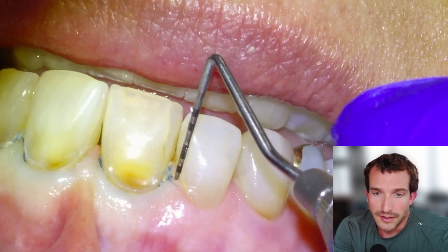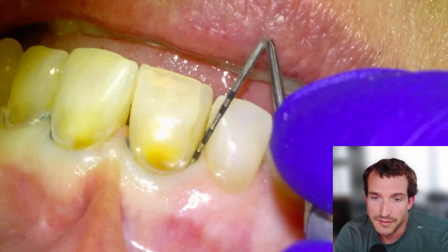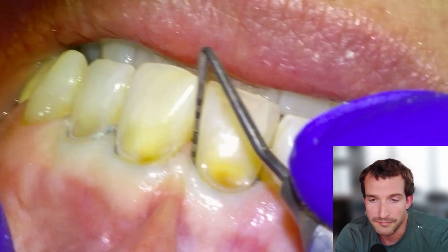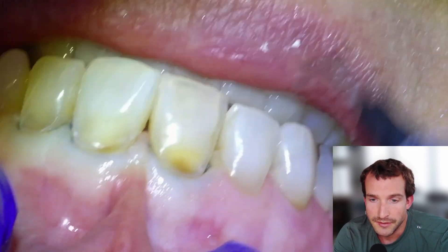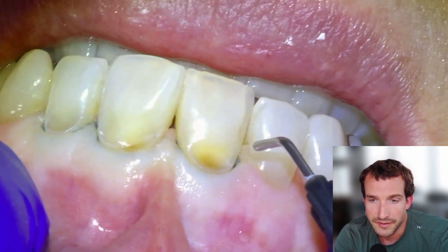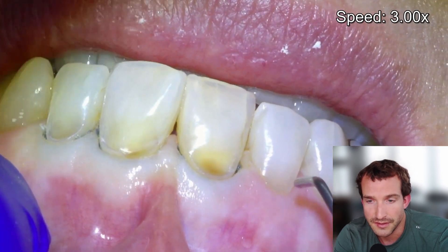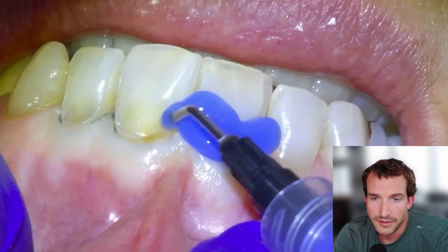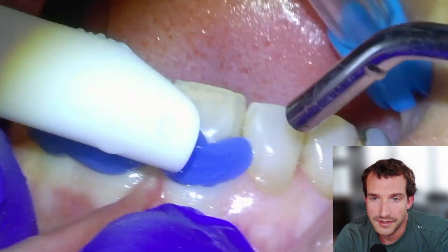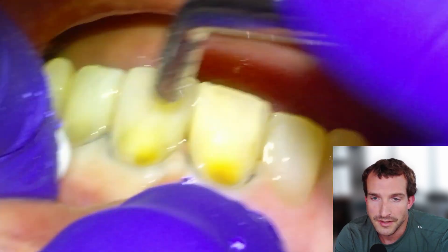That's all I really use — just Fuji and Equia. I haven't bonded composite in probably over three years, and I see better outcomes having given up composite. So we're going to etch for five seconds with phosphoric acid on all three teeth, then rinse thoroughly.